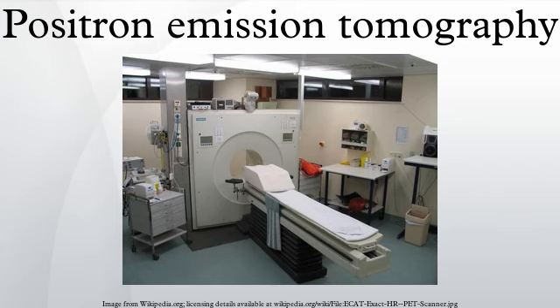The presence of the small on-site cyclotron promises to expand in the future as the cyclotrons shrink in response to the high cost of isotope transportation to remote PET machines. Because the half-life of fluorine-18 is about 2 hours, the prepared dose of a radiopharmaceutical bearing this radionuclide will undergo multiple half-lives of decay during the working day. This necessitates frequent recalibration of the remaining dose and careful planning with respect to patient scheduling.